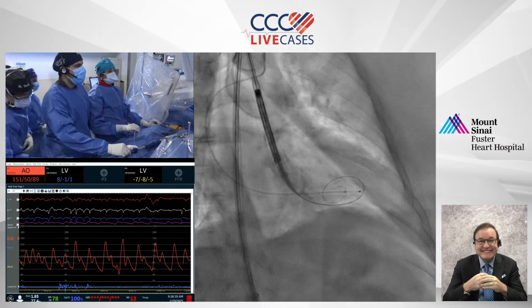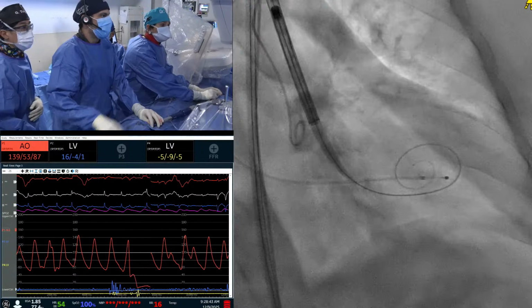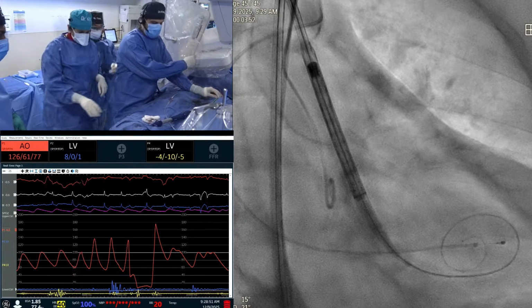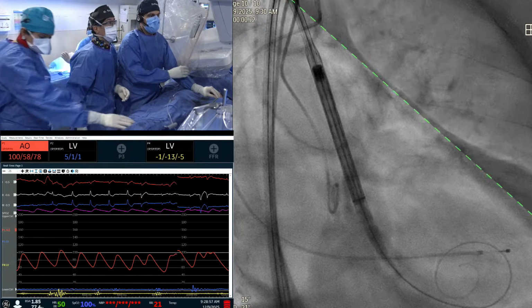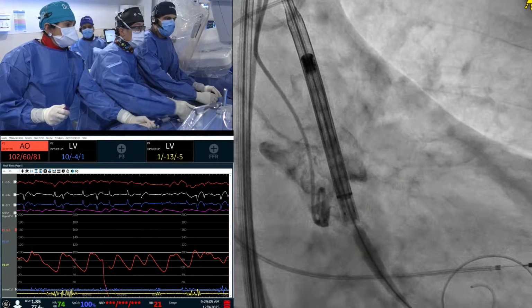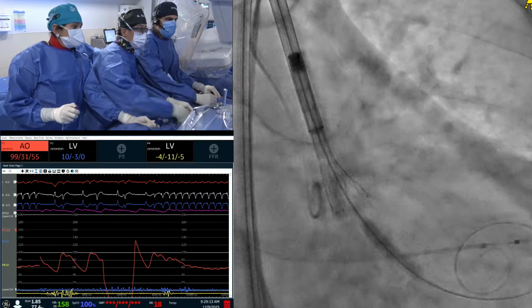Good question. Let's put it this way, there is no data available to favor one valve versus the other. We actually had a review paper in JAMA Cardiology about 3-4 years ago, and the data have continued to show this. The one thing we know for sure, in the short term in small annuli, is that the self-expanding valve is the winner. Besides that, multiple studies, including the CHOICE trial, with up to 5-7 year follow-up, have shown similar outcomes. So nobody has been a winner yet, except in small annuli, where self-expanding is the winner. And that is what we are using in this particular case.